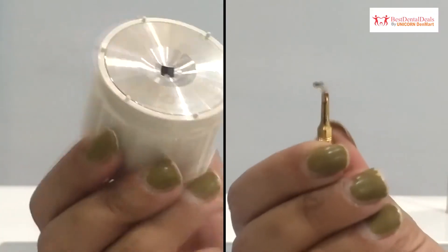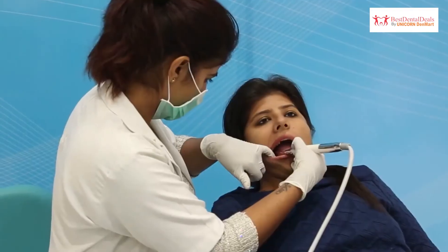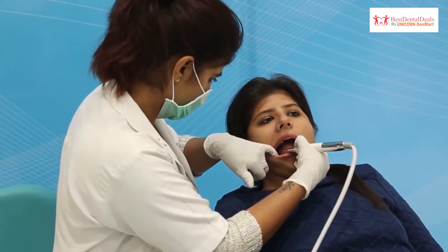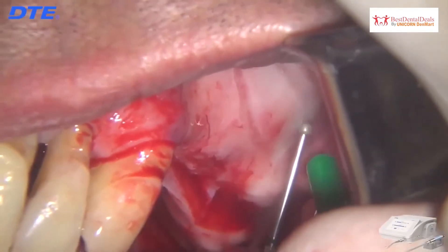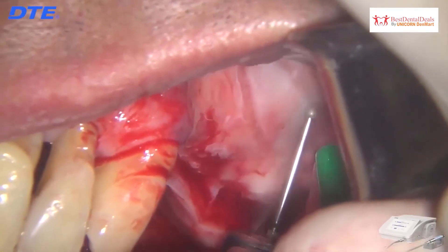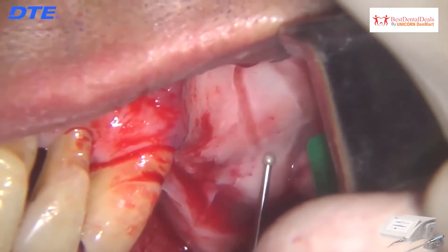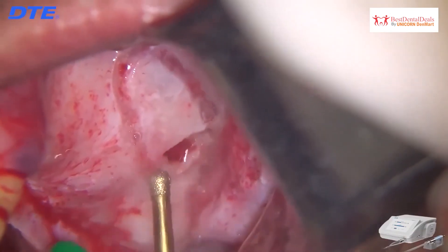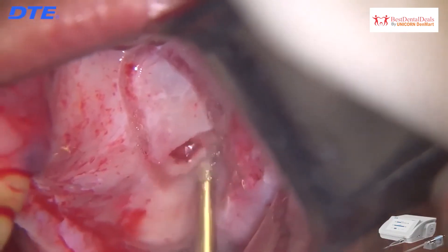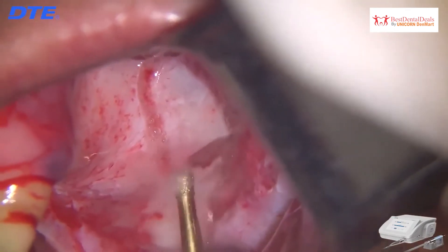The unit comes equipped with a chuck for tip attachment to the handpiece. This advanced technology is an advantage over conventional rotary technique, cutting bone without damage to delicate anatomical structures — making it quite effective in sinus lifting and nerve relocation. Surgery X from DTE offers better post-operative healing and minimally invasive bone cutting with a clear operation site.